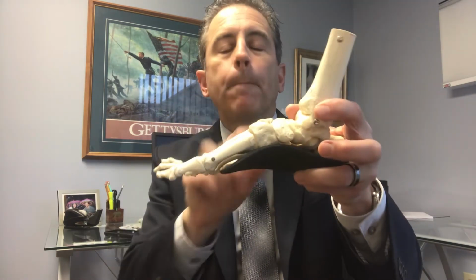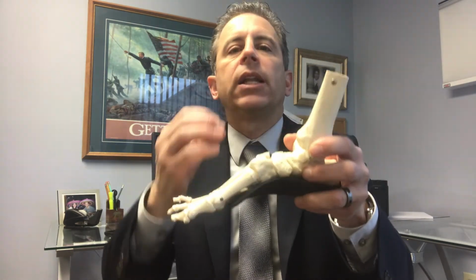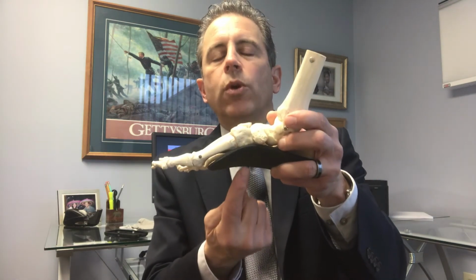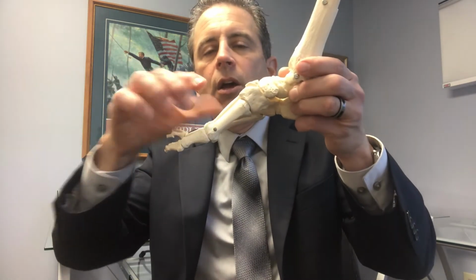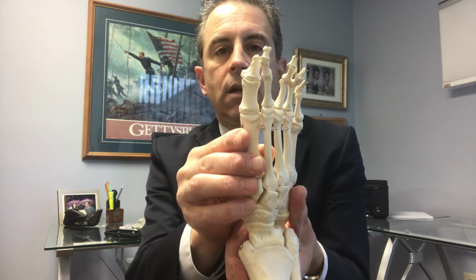So how can a properly fitting and calibrated orthotic address this? Let's say this orthotic fits this foot perfectly, matches the arch perfectly, and it's calibrated so that when you stand on the floor, it allows the arch to go down just enough to be able to absorb shock and walk comfortably. The first metatarsal head will go up as appropriate, but now when you go to step forward, the arch support will raise that arch all the way back up to the top. Well, now when you step forward, the forefoot will be rigid, the first metatarsal head will be down, and it will be more straight. That's how a properly fitting and calibrated orthotic will function to slow down or prevent bunions from occurring.